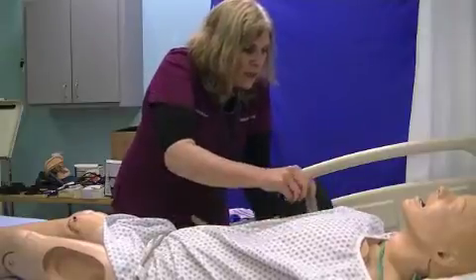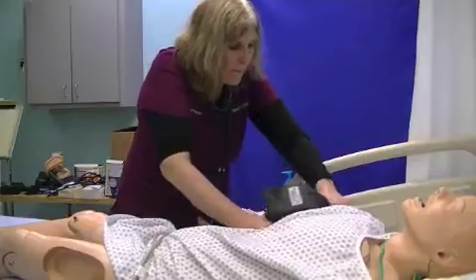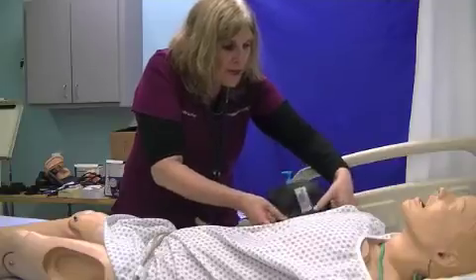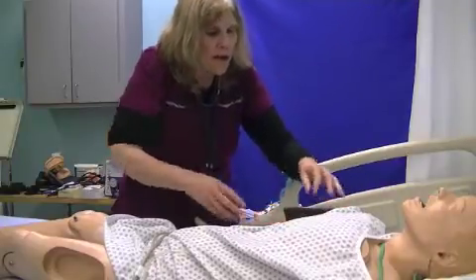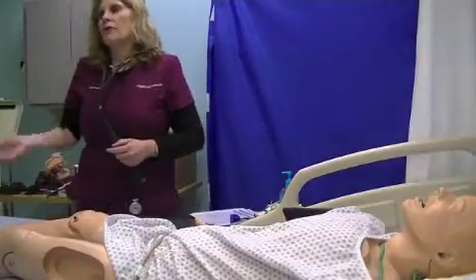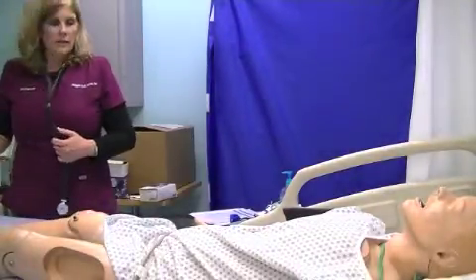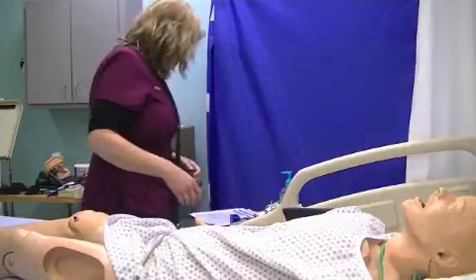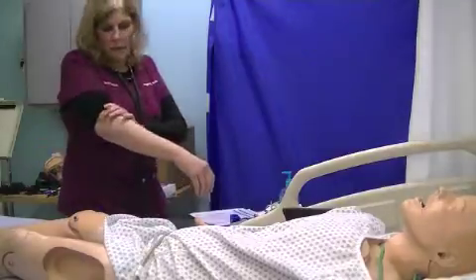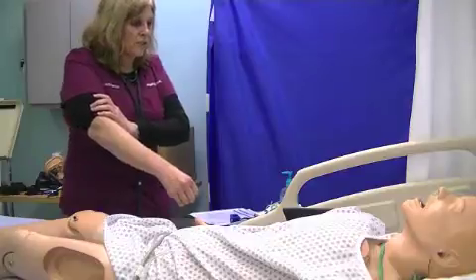If you have somebody that has a larger arm, you're going to make sure that you have a large cuff. Just like if a person has a small arm, use a small cuff, because if the cuff is too tight on somebody that has a larger arm, you're going to get a false high reading, or if it's too loose, you're going to get a false low reading. So you want to make sure that's not what happens. And also the sleeve needs to be up, because a lot of places will grab your arm and do it over clothing, and that causes constriction, so you don't want to do that.